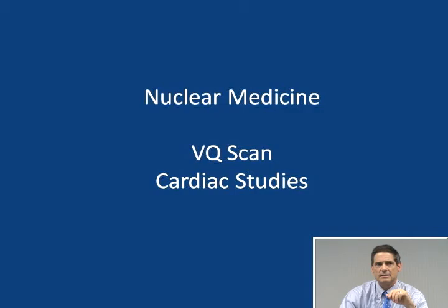Nuclear medicine studies, there's a couple of different kinds of nuclear medicine studies that are performed in people with chest pain. Primary care providers may order ventilation perfusion lung scans for patients suspected to have pulmonary embolism and who can't have a CT angiogram because they've got contrast allergy or have renal insufficiency.